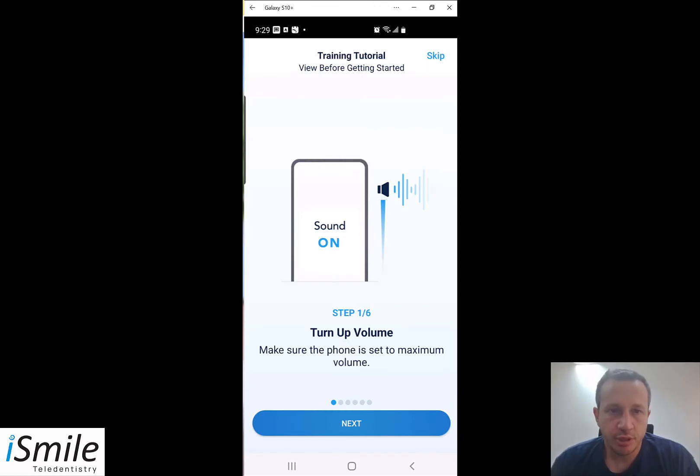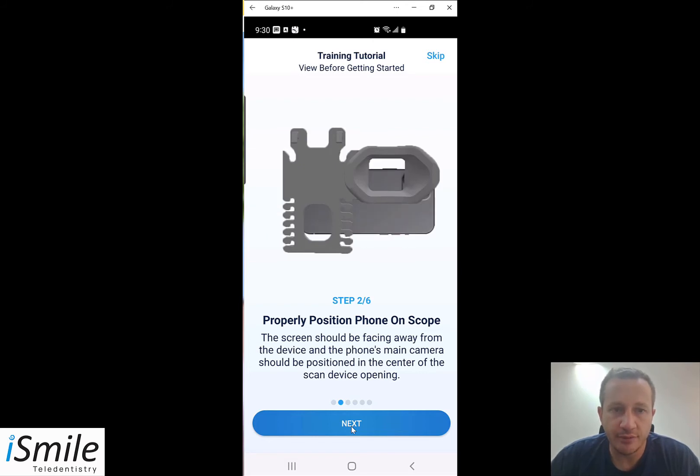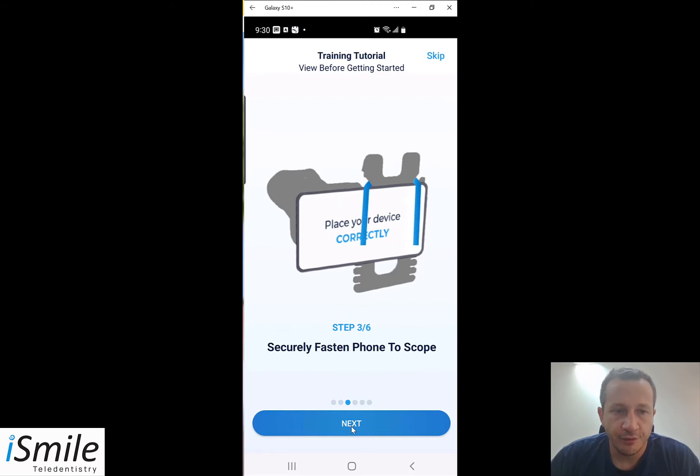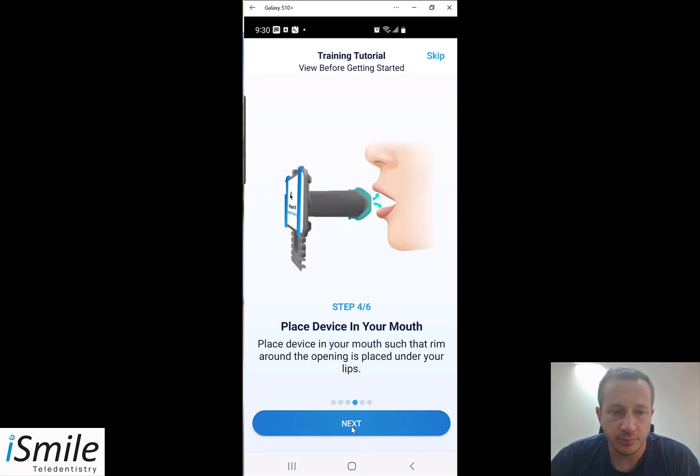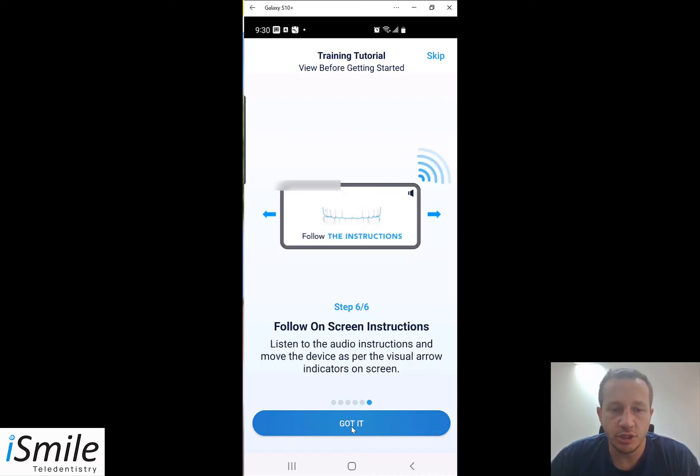The first time you open the app you will see a training tutorial that appears on screen. Don't do anything with the scope and your cell phone yet — just watch the video tutorial. The tutorial outlines the process: step one is to turn up the volume on your cell phone; next, properly position the phone on the scope as explained earlier; fasten the phone to the remote monitoring scope securely with the included band; place the device in your mouth; press the start scan button in the app and follow the on-screen instructions.